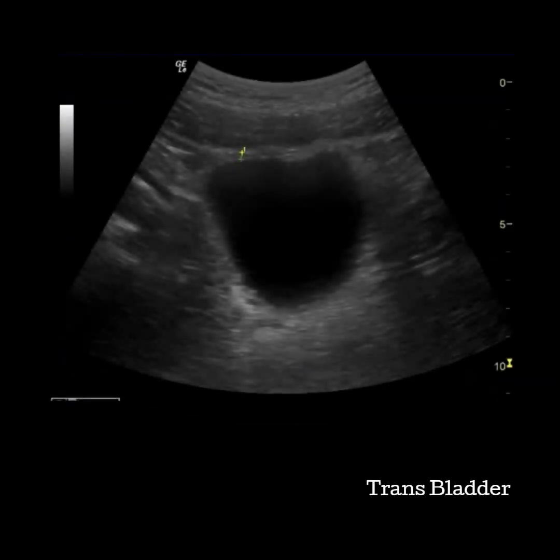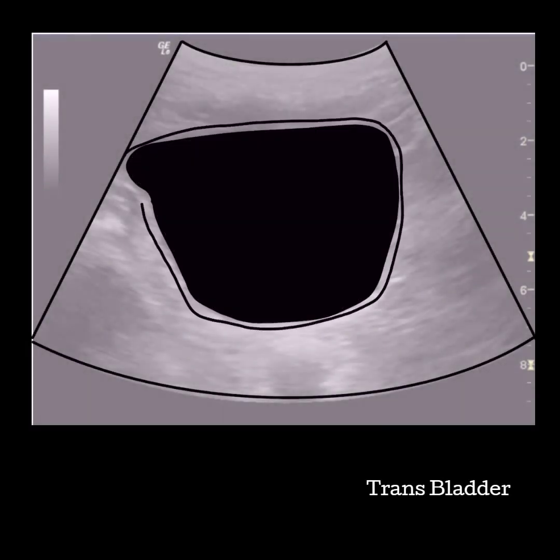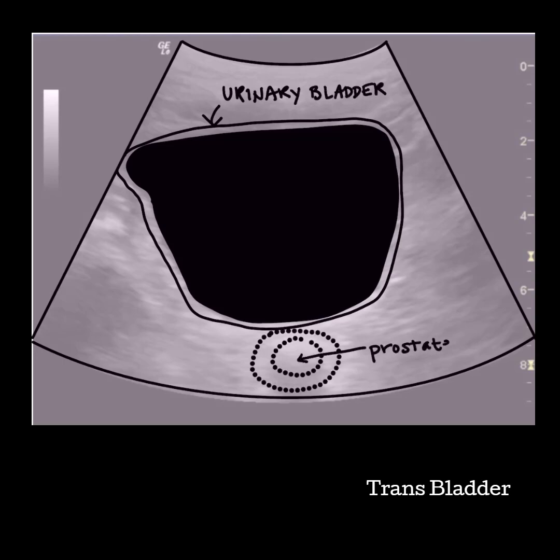If you need to measure the bladder wall, the transverse view offers a good window to measuring the anterior or lateral walls. The normal bladder wall should be less than three millimeters when the bladder is distended, but can measure up to six millimeters with partial distension. The transverse bladder usually takes on more of a square appearance when full and a little more rounded when partially full. An empty bladder can be difficult to see; however, using the prostate and the uterus as landmarks may be helpful.